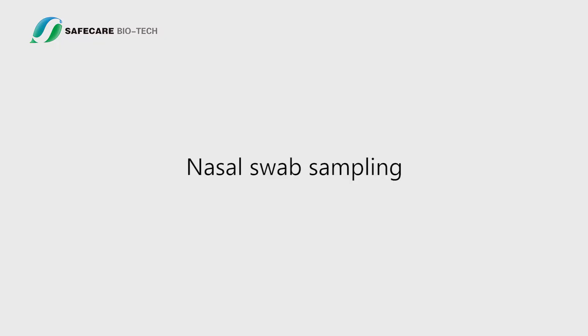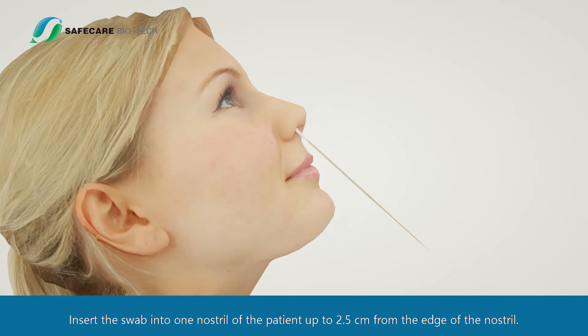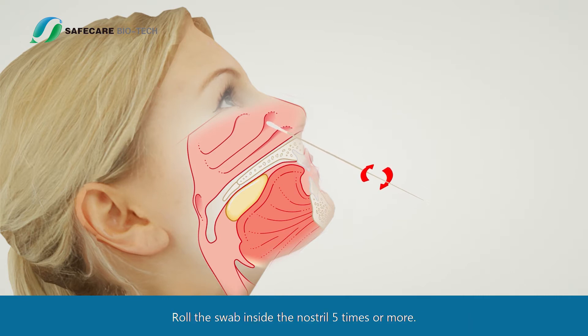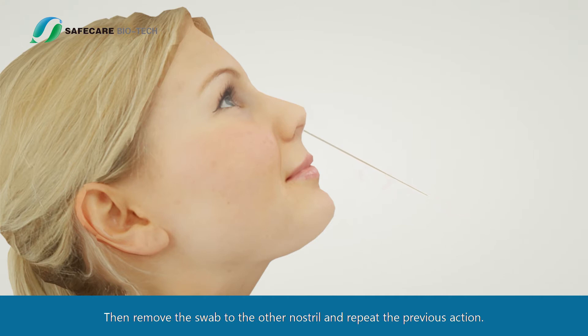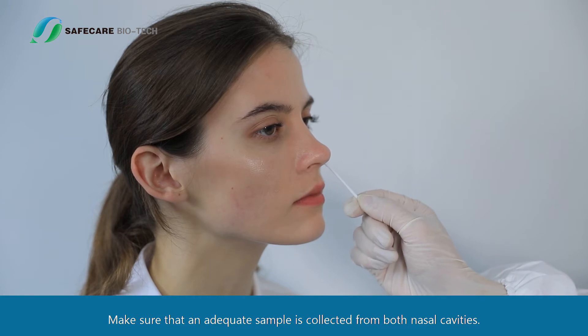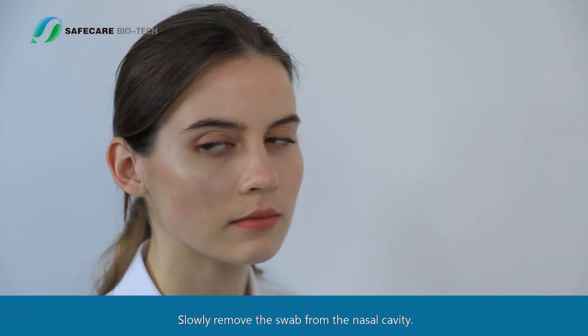Nasal Swab Sampling: Tilt the patient's head back. Insert the swab into one nostril of the patient up to 2.5 centimeters from the edge of the nostril. Roll the swab inside the nostril five times or more, then move the swab to the other nostril and repeat the previous action. Make sure that an adequate sample is collected from both nasal cavities. Slowly remove the swab from the nasal cavity.